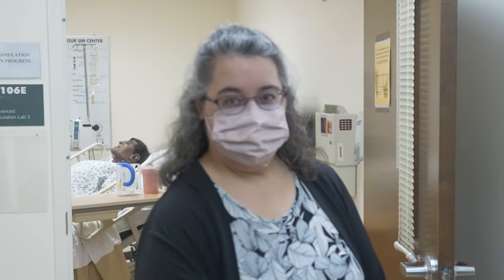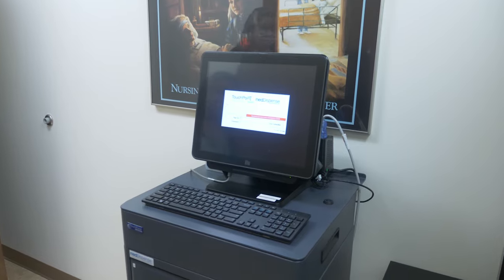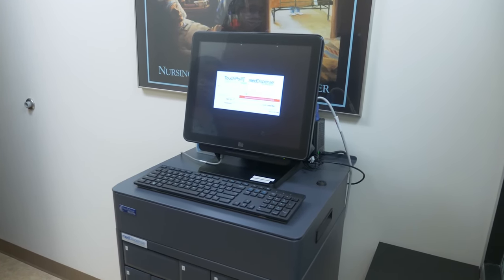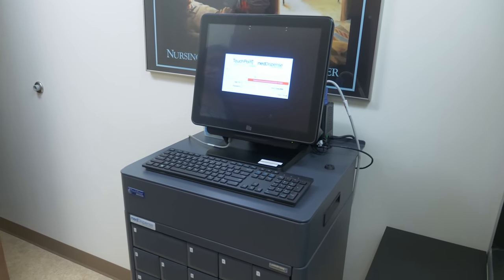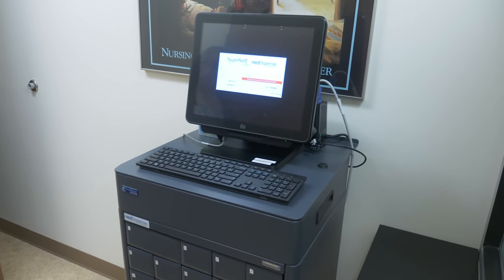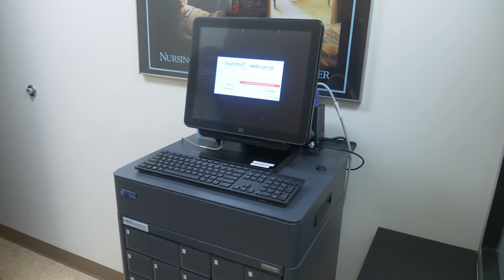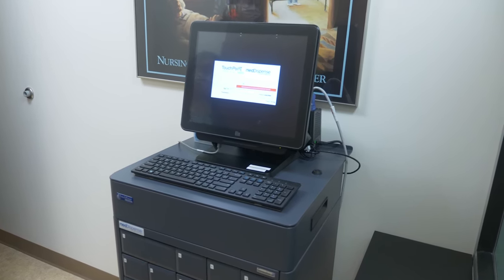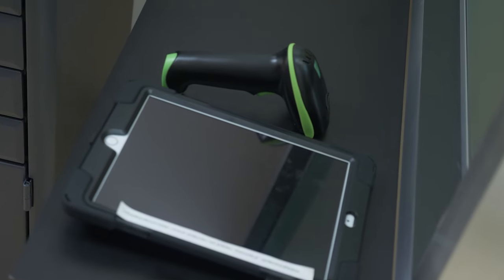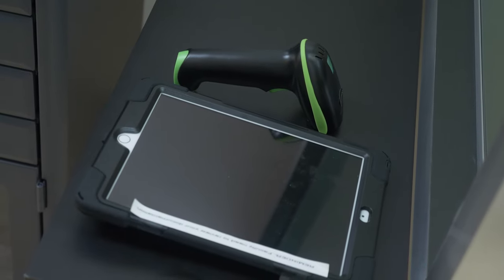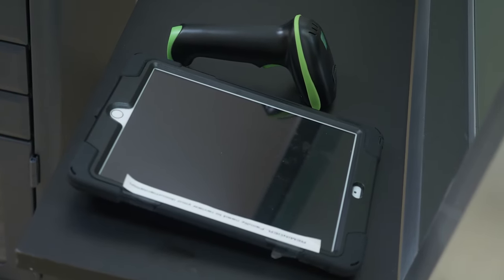Here is our medication dispenser. Just like in the clinical setting, students withdraw their medications from a locked computerized cabinet and scan the patient's barcode to administer the medications. We do try to keep everything as close to the clinical setting as possible.